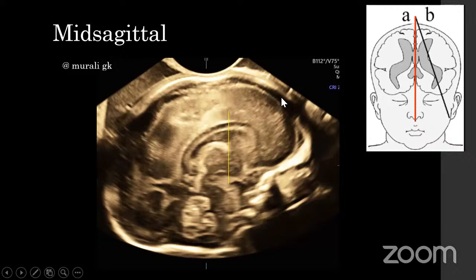You're seeing the occipital bone. Medially, you're seeing a shining surface, that's nothing but the falx. Then you're seeing a C-shaped curvilinear structure, that is the corpus callosum. A line which meets the anterior margin of the tela choroidea divides the subcallosal space into a cavum septum pellucidum anteriorly and cavum vergae posteriorly. You are looking at a bright C-shaped structure sitting on the thalami, which is nothing but the roof of the third ventricle. On the roof is the tela choroidea of the third ventricle.